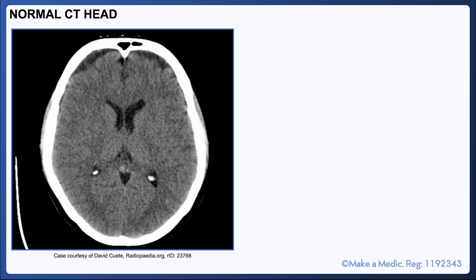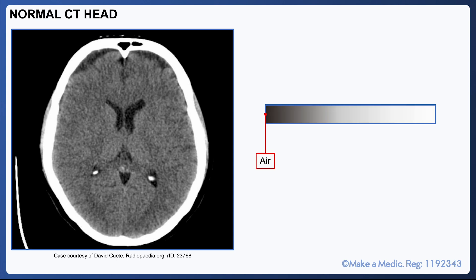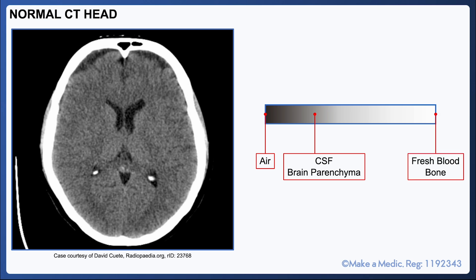CT head scans can be complicated to interpret, so we're only going to focus on the main conditions most likely to come up in exams and clinical practice. First, let's look at what the colors on a CT head scan mean. In general, black is air, various shades of dark gray are CSF and brain parenchyma, and on the white or hyperdense end of the spectrum is bone and acute bleeds.